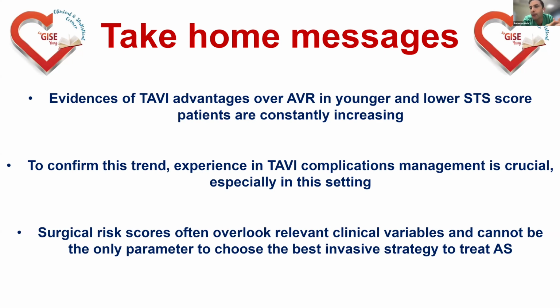So in this case, you had no trouble. You had only a small dissection on the other side while retrieving the system. But I would have put anyway, especially in young patients, a small wire to be sure that if something happens, I am protected and I can at least spare time to use my rescue strategy. Okay. Roberto, you use contralateral access, the radial one? From the radial one, please.